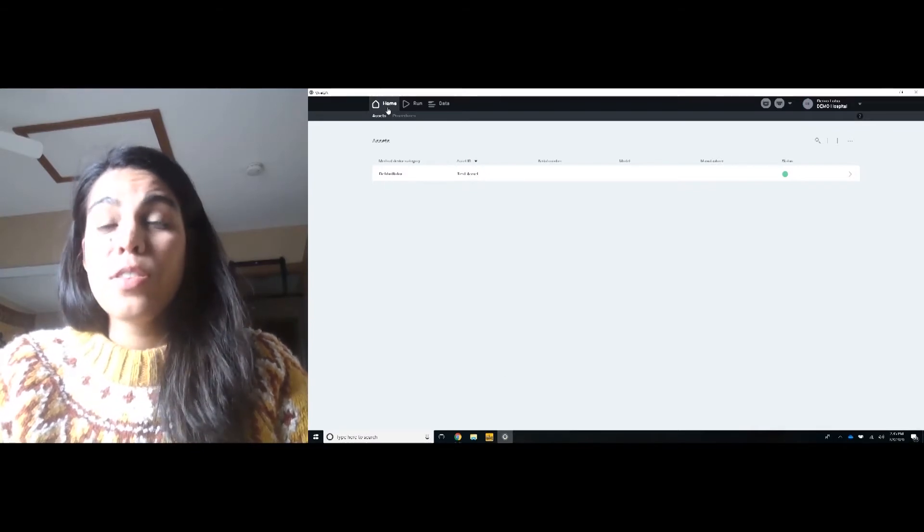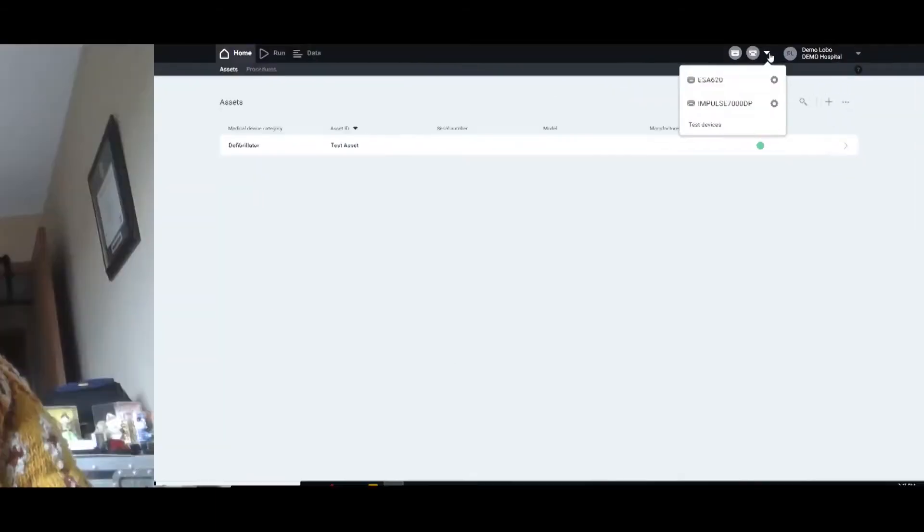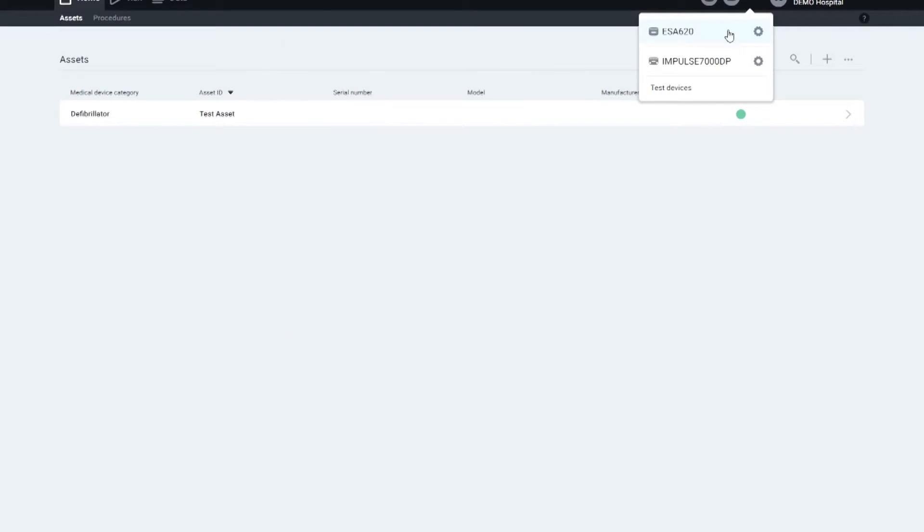So this is your home. The first thing that you do is connect your Fluke equipment to your computer using the USB port. I've connected my ESA and my impulse.